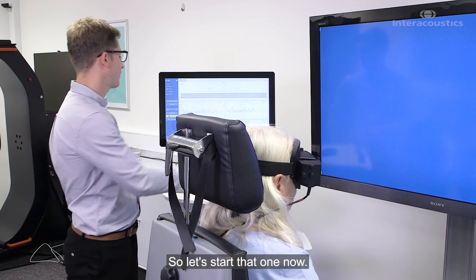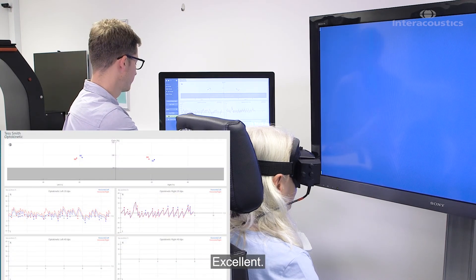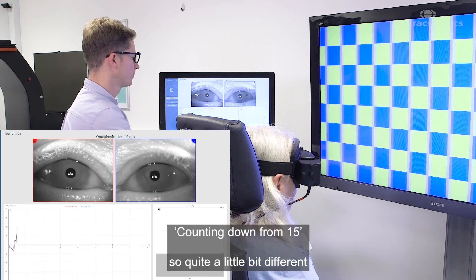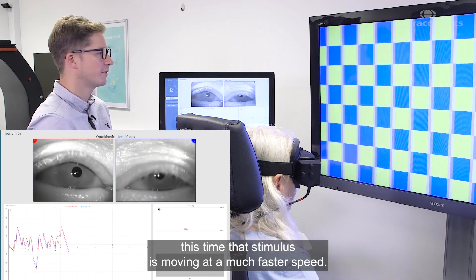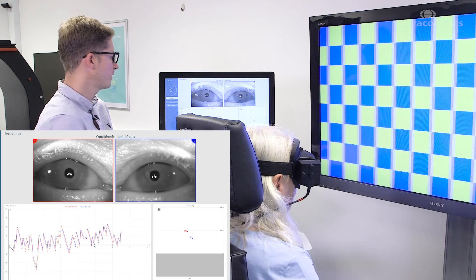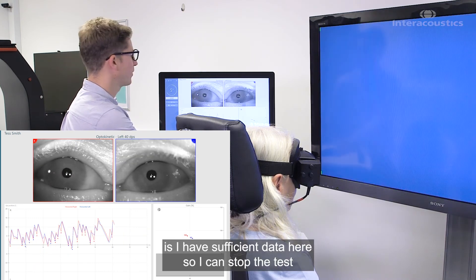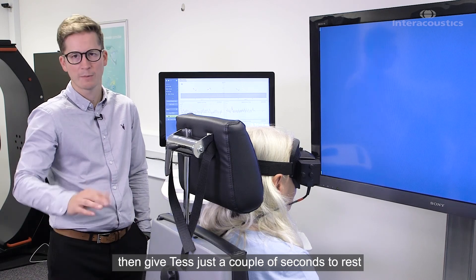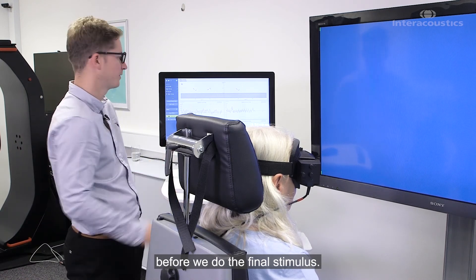Let's start that one now. Are you ready, Tess? Excellent, here we go — counting down from 15. It's quite a bit different this time; the stimulus is moving at a much faster speed. I have sufficient data here, so I can stop the test and give Tess just a couple of seconds to rest before we do the final stimulus.